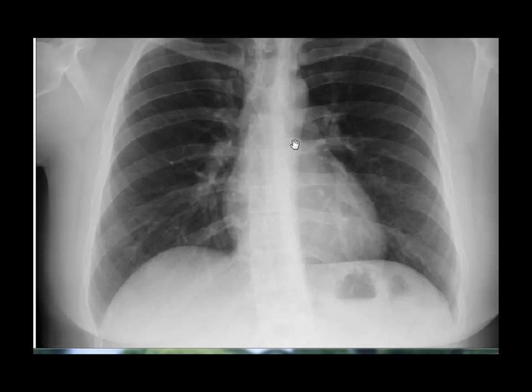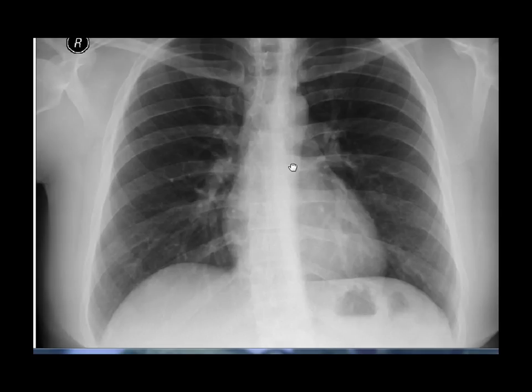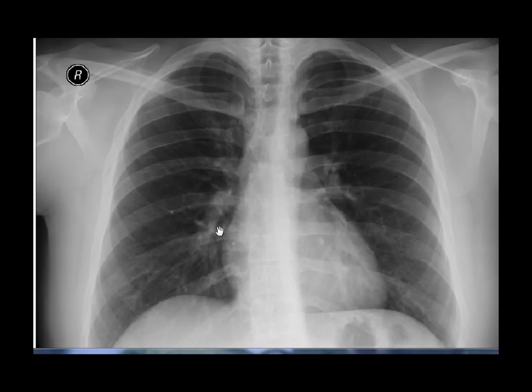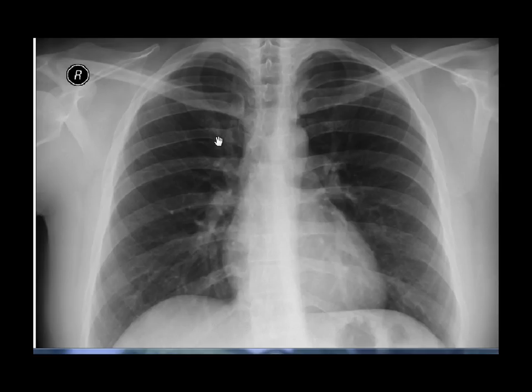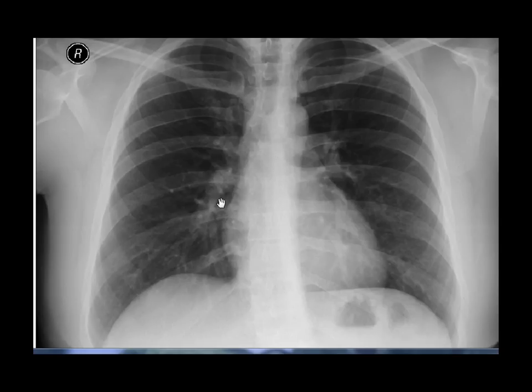For reference, here is a normal chest X-ray. Notice that the perihilar vessels are clearly defined, the lower lobe vessels are bigger than the upper lobe vessels, and you can actually trace an outline of all the major vessels that are visible.